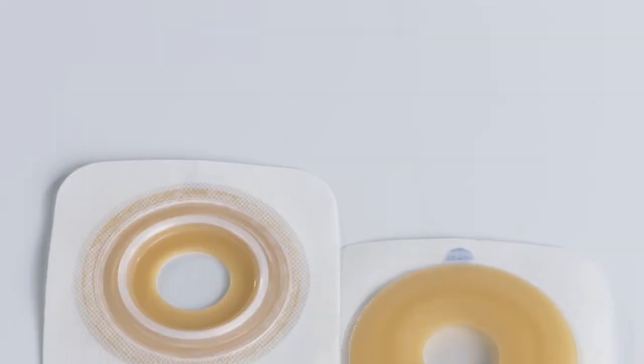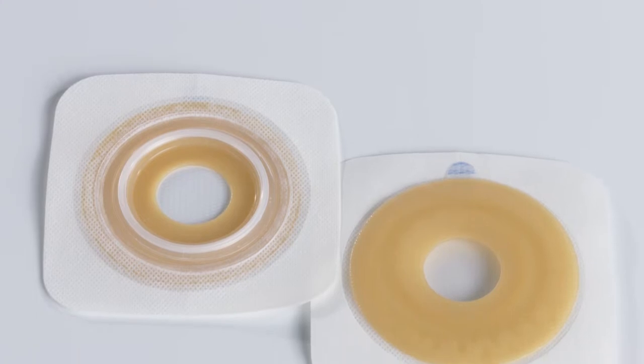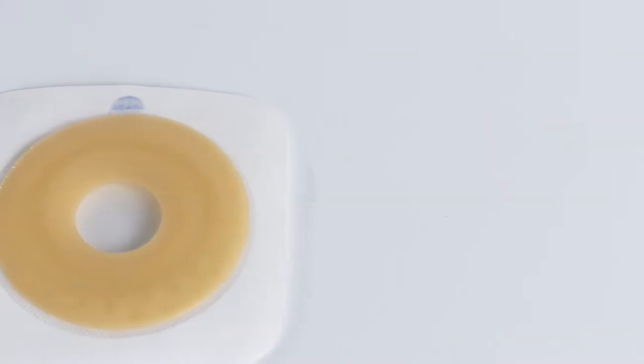The Natura Moldable Skin Barrier provides a custom fit and is gentle on the skin, secure and easy to use.